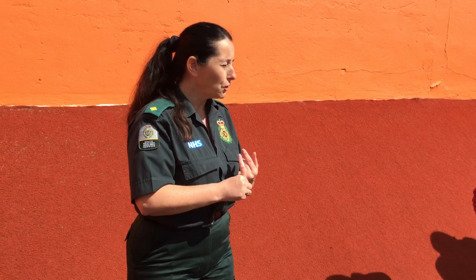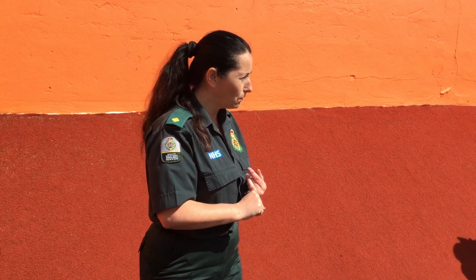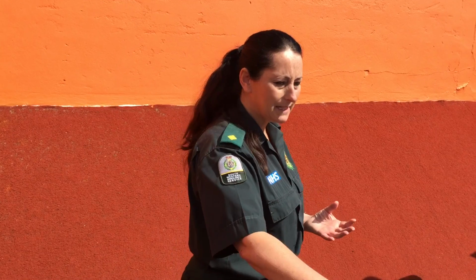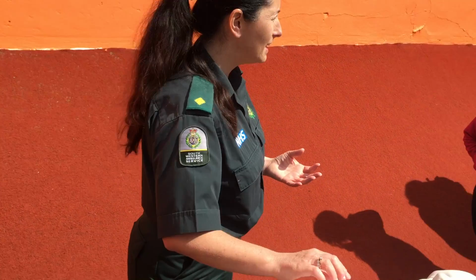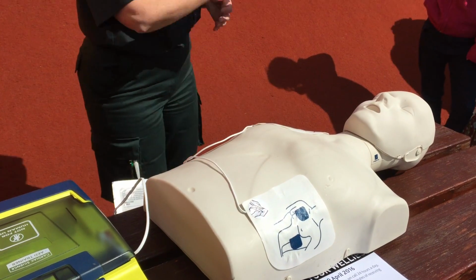Okay, so you've also got perspiration. So you need to dry the chest off. Somebody in cardiac arrest will be sweating and perspiring an awful lot. You need to dry the chest off. Patches, things like plasters, nicotine patches, only need to be concerned about them if they're underneath where the pads are. All right, okay. Just quickly peel them off.